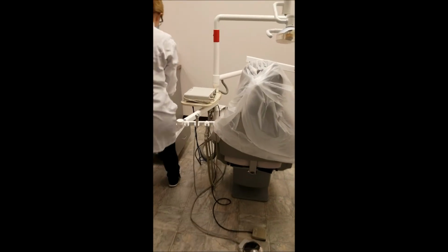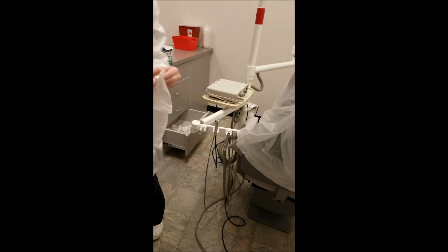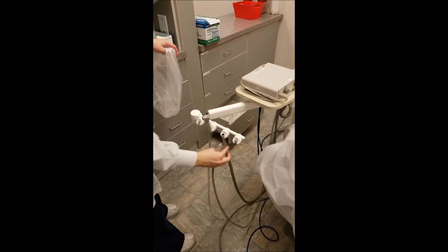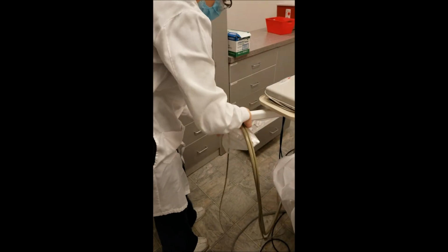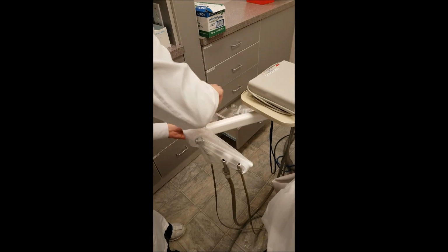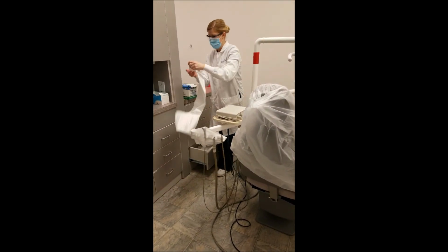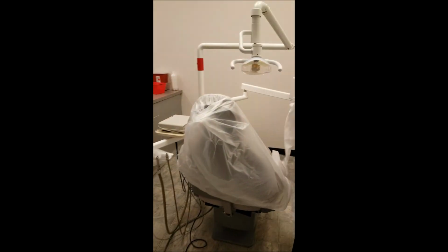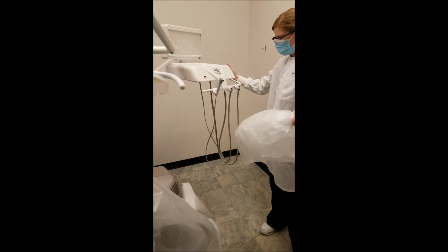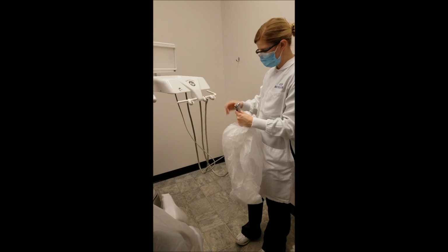And then the accessory arm. So helpful hint, you will be using the saliva ejector and the HVE, so leave those out. And then the bracket tray. I'm going to lift my bracket tray up, that way I can get my bag underneath it without my bag hitting the floor. And I'll leave out the air water syringe and the handpiece hose with the black on it.